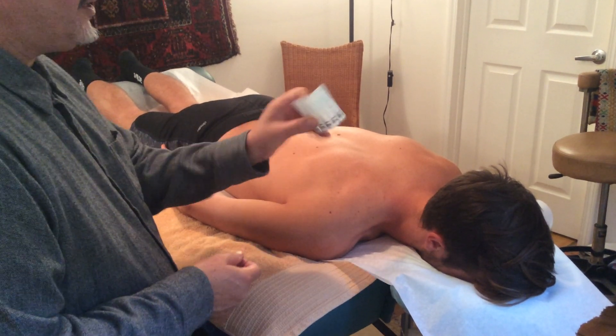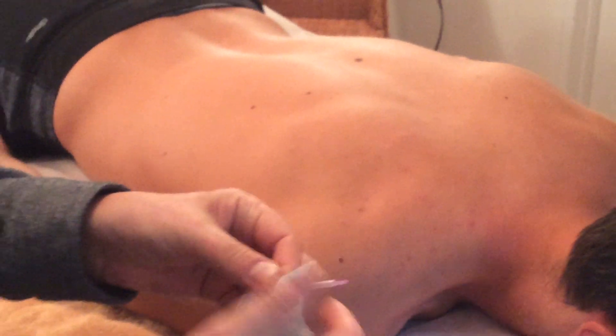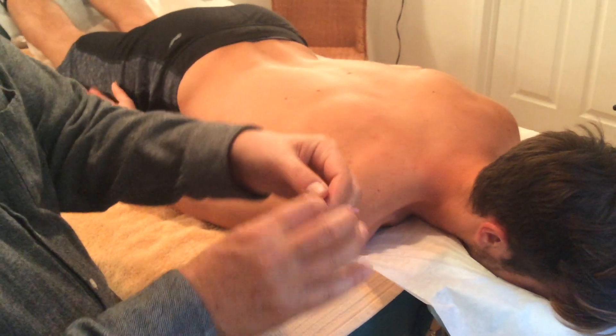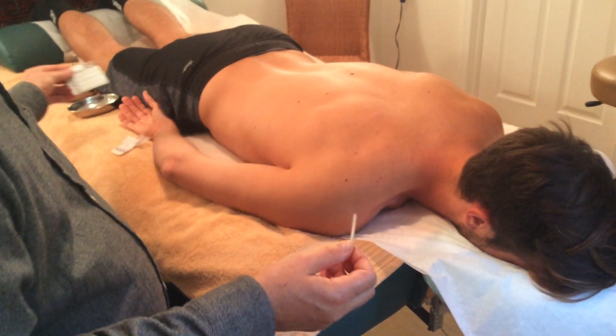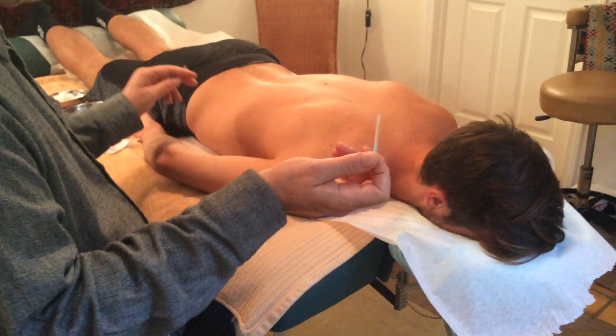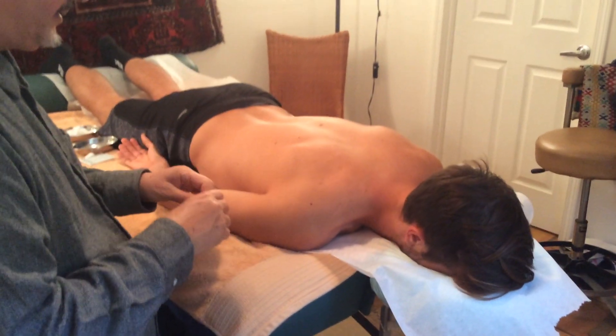So these are the needles — the Japanese needles. They are all sterile and disposable and they come in these little packets. You open it up like this, and there's your needle, your sterile needle. It's in a little plastic sleeve where the tip is still protected.